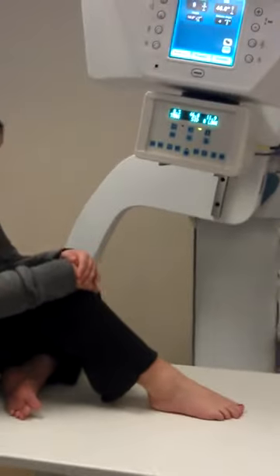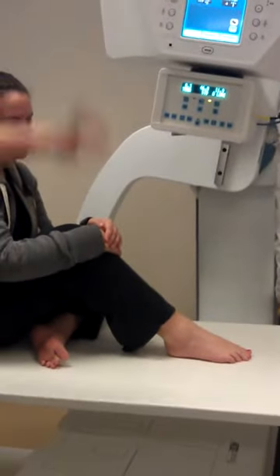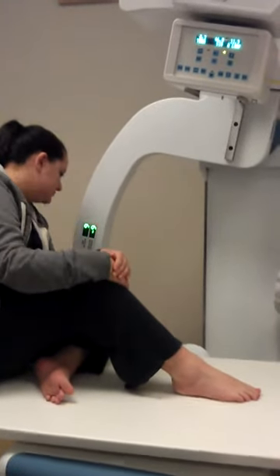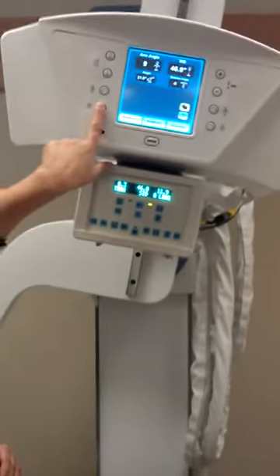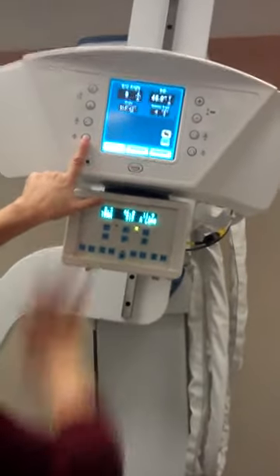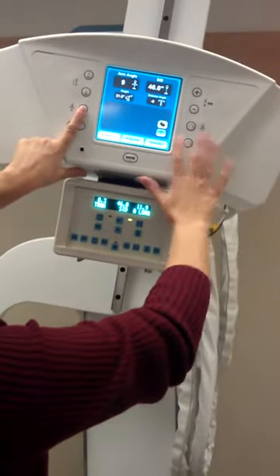If you lower it, then you angle it, and then we can straighten this out — it needs to match that. So if it's 9, it needs to be negative 9. That flattens this out. Then you raise this back up, close to the table but not hitting the table. This is the angle for the table, and this is the angle for this — they're opposite. So if you're angling this way, this one's going to flatten it out. If it was to angle this way, this one's going to flatten it out.